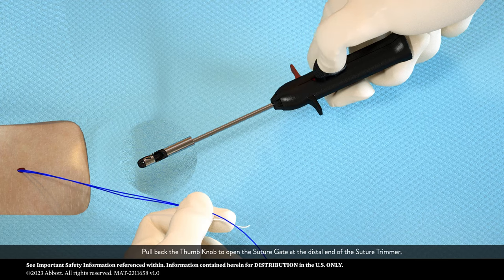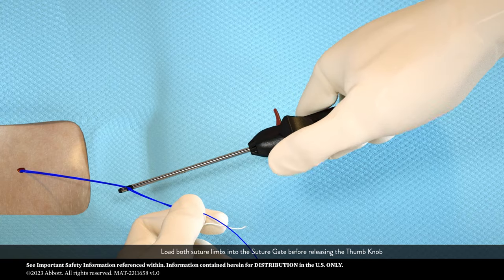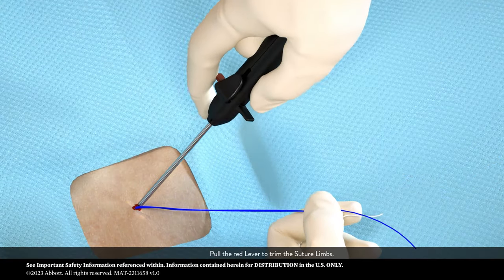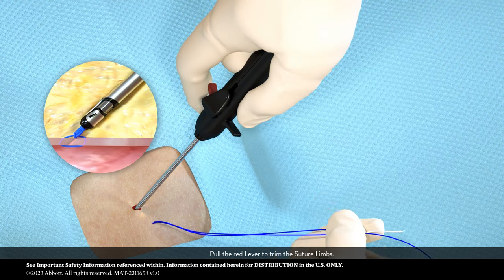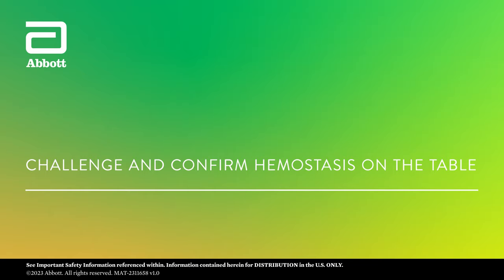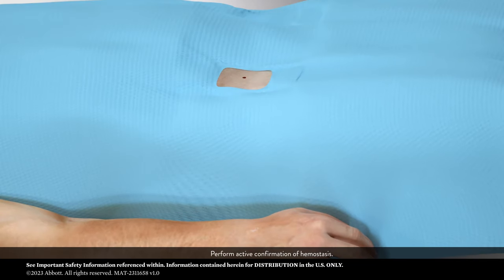Pull back the thumb knob to open the suture gate at the distal end of the suture trimmer. Load both suture limbs into the suture gate before releasing the thumb knob. Pull the red lever to trim the suture limbs. Perform active confirmation of hemostasis.